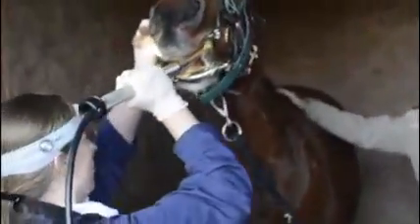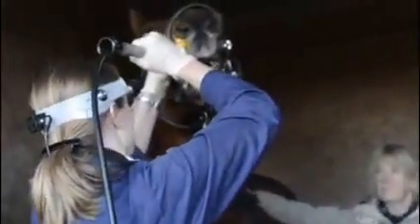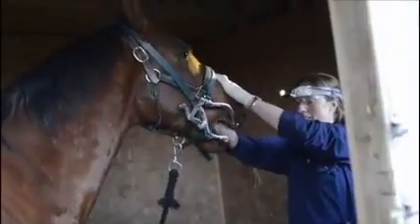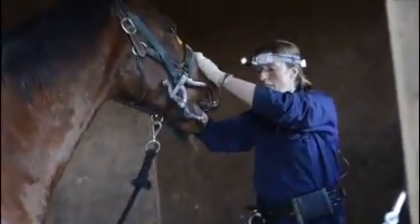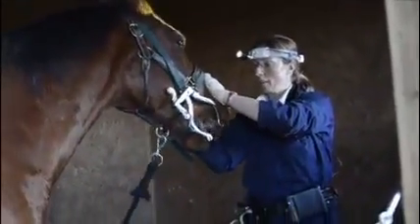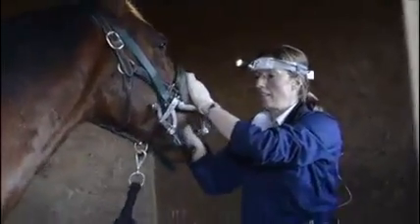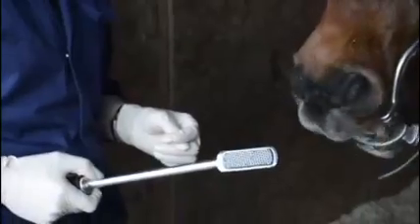Are you okay? Let's see there. Well done. It's fine, that little fractured bit. It feels like there's nothing trapping in there, it's not painful, I'm pushing it now, it feels like the bit of tooth that still remains underneath it is wearing down quite normally.